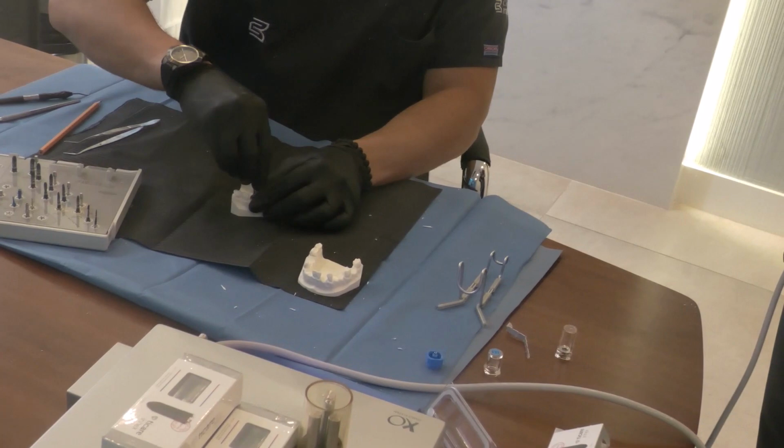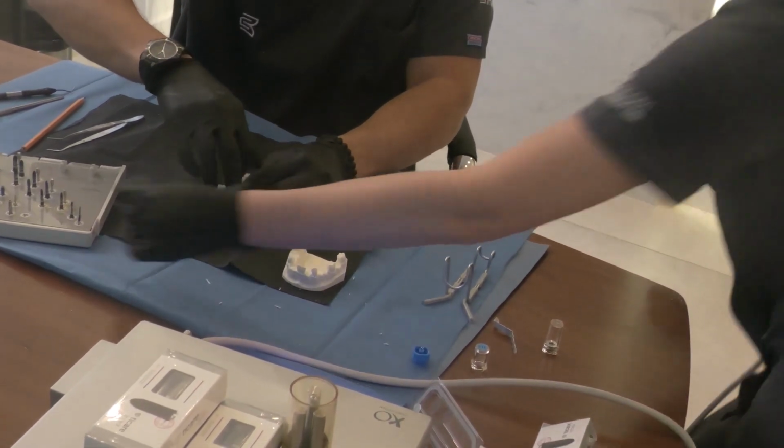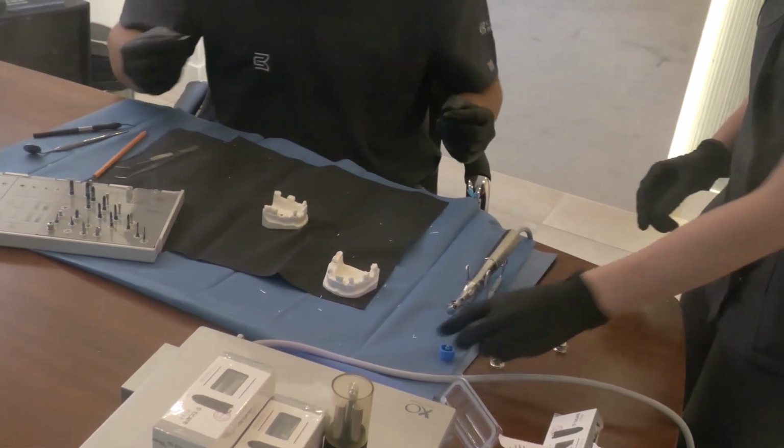So now we're going to be placing the cover screw, which is within the same case, and you can use the same screwdriver. My suggestion is the following.